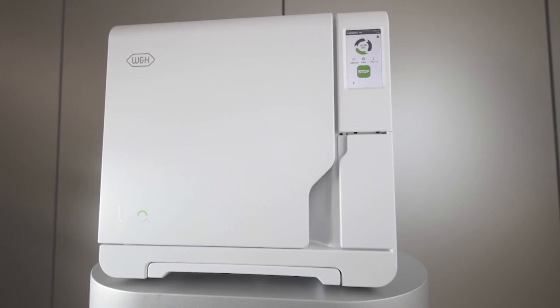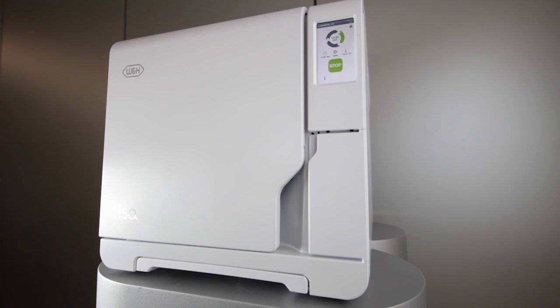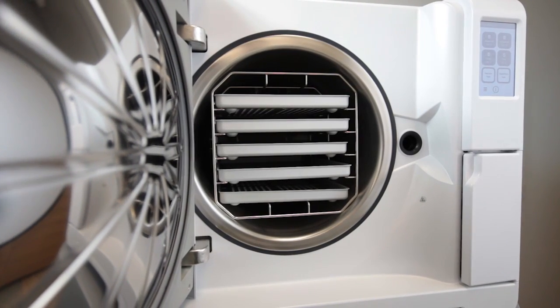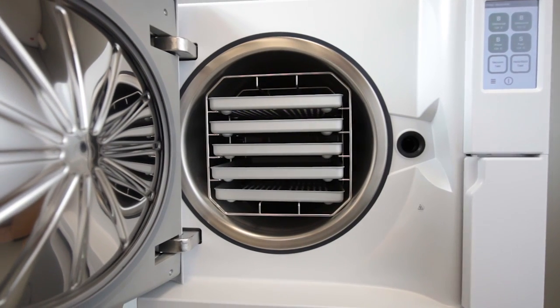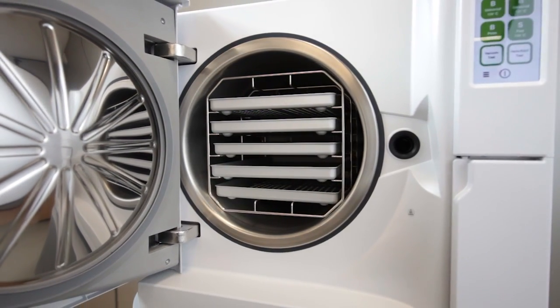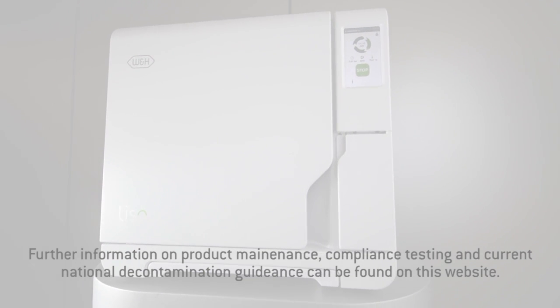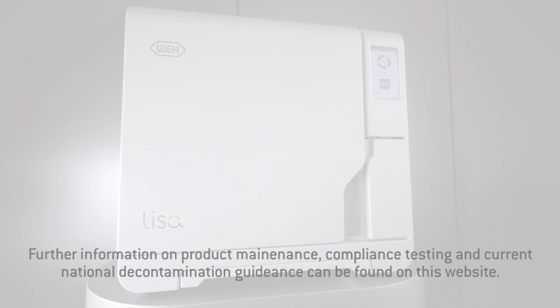Once a positive Helix test cycle has been completed, your Lisa sterilizer is ready for normal operation again. We recommend, in accordance with your national guidelines, that you document all test results in a sterilization test logbook and that you retain the indicator test strips. The Lisa sterilizer saves the digital test reports in the device memory and also on the USB stick if available.